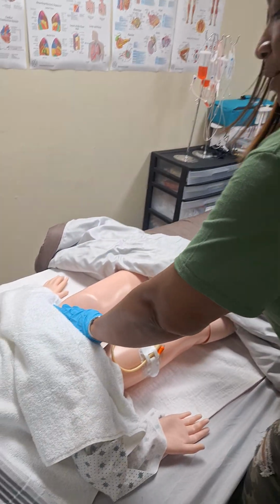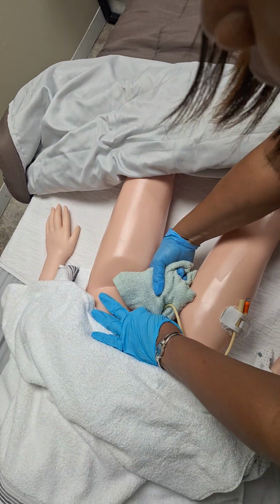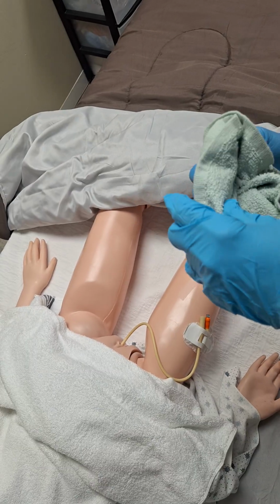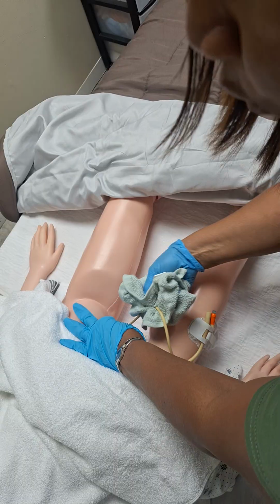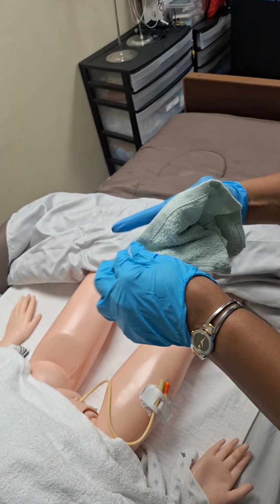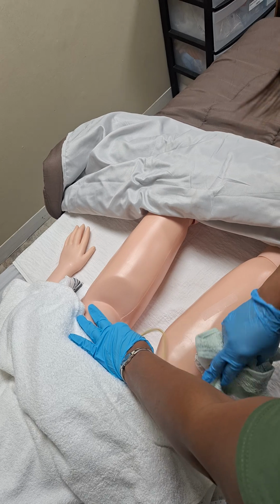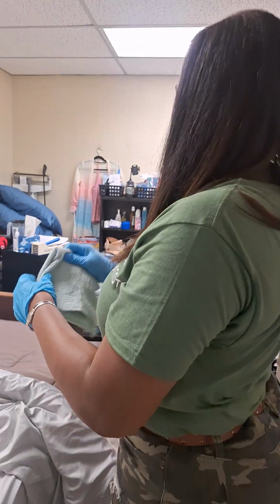I'm going to hold at the tip again, at the tip of the catheter, at the meatus, and I'm going to grab the catheter and I'm going to wipe 3 to 4 inches down. Wiped it once. Going to grab it again at the meatus. Wipe it twice, all the way down 3 to 4 inches. My last wipe, I'm going to hold it again, holding at the tip of the meatus, wiping down 3 to 4 inches, all the way down. Whatever I wash, I rinse, I now must dry.